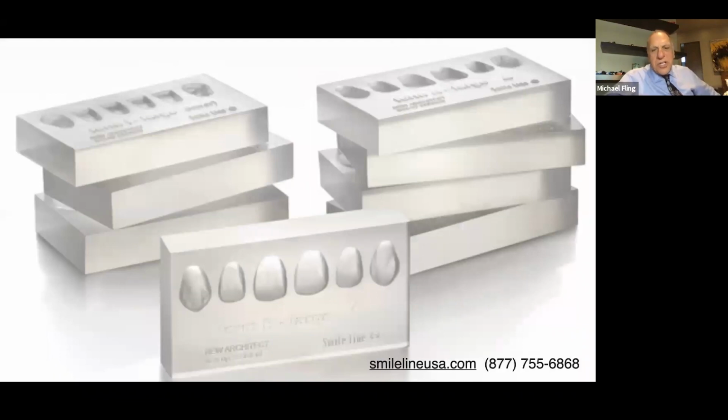Here's another way to cheat. If you want to, you see the website phone number there, 877-755-6868. This is where we get silicone forms for anterior teeth. And once again, we fill these with wax and they're kept in the little container. So if I want to wax anterior teeth, we can cheat with that also. They have upper and lower anterior teeth. So I would encourage you to get those too.